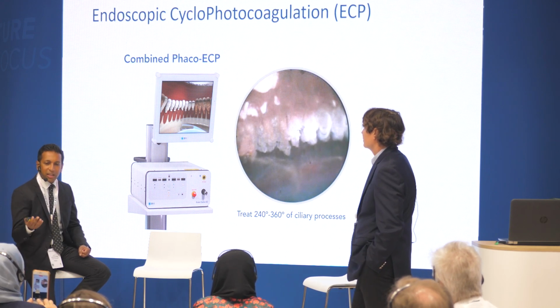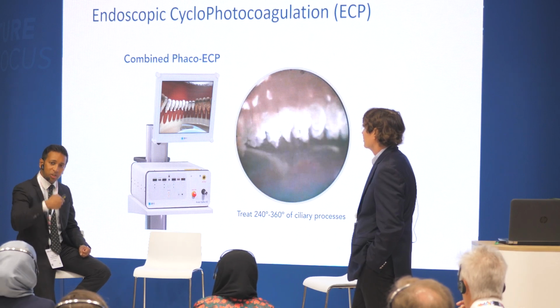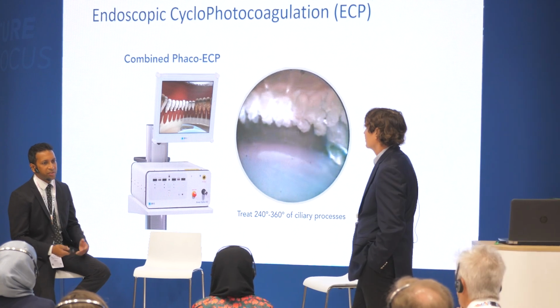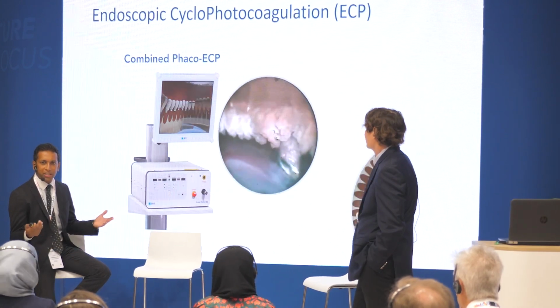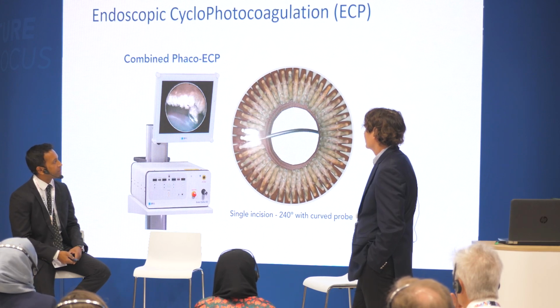And that also rotates the ciliary body posteriorly, which Robert alluded to. Particularly in plateau patients, it can create more space in the anterior chamber and open up the angles further.